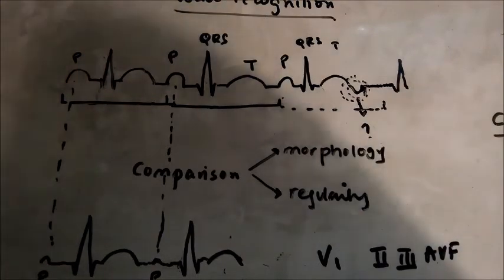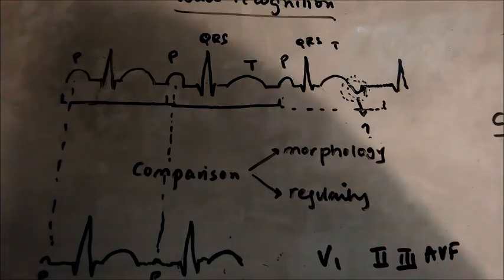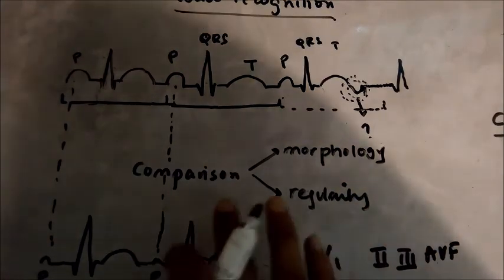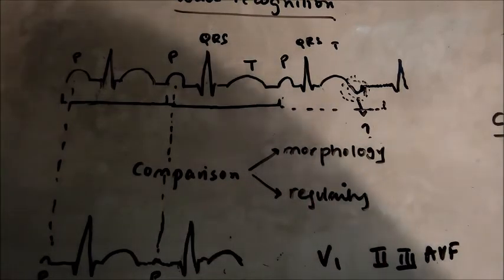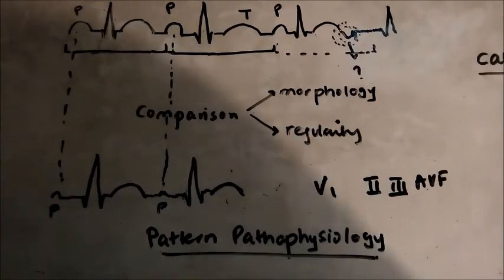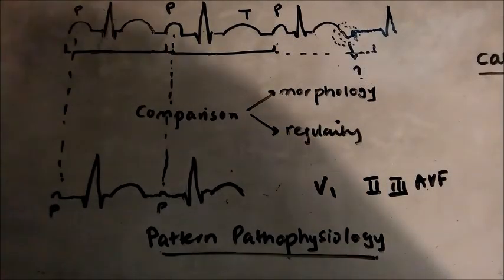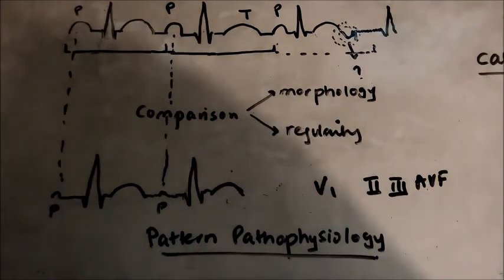Right? And you need to look for regularity, whether you have an early wave occurring, whether it's occurring on time or not, right? So comparison is very, very critical. But there's another thing, and that is pattern pathophysiology. What that means is that you should not just know patterns, but you should know the reason why these patterns are occurring.